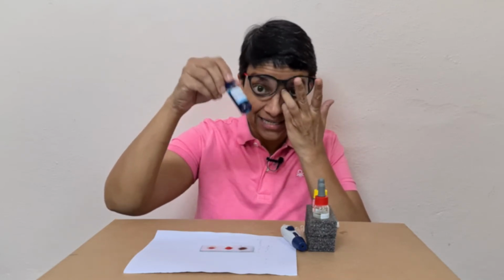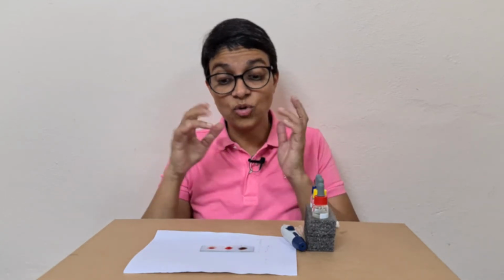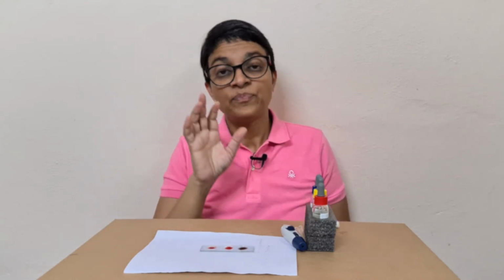Sorry, if you have antigen A, and then you add antibodies, the antibodies and the antigens will react with each other and form visible clumping. Based on that, that's a hemagglutination reaction, and that is how you see your results and interpret your results.